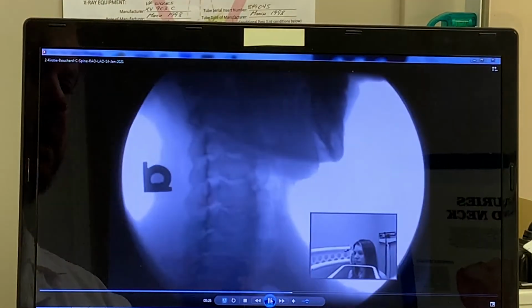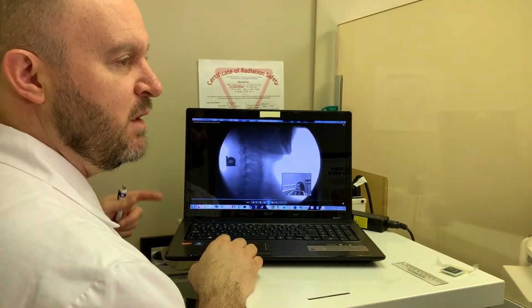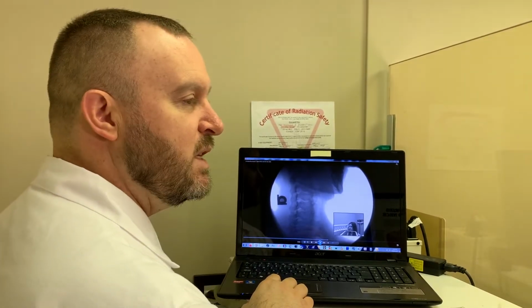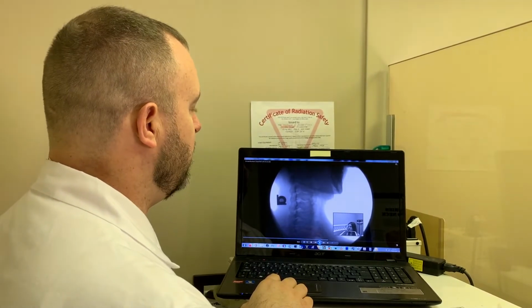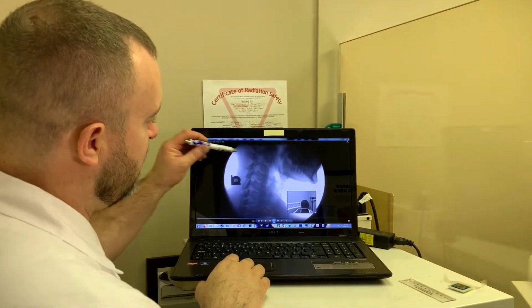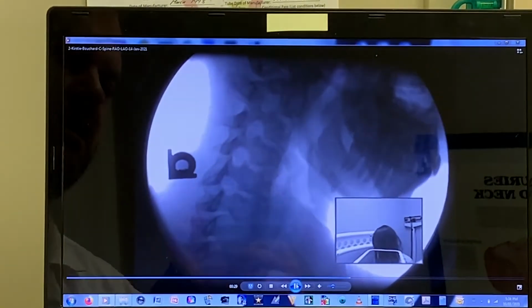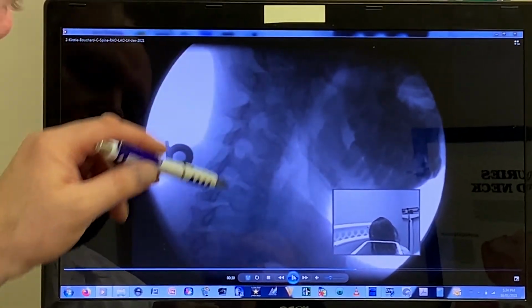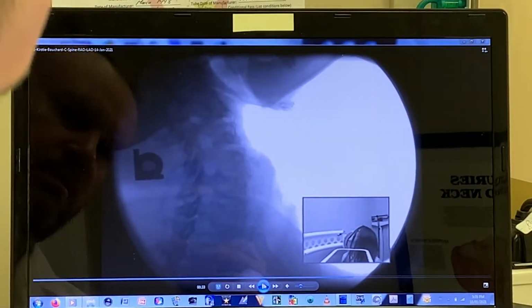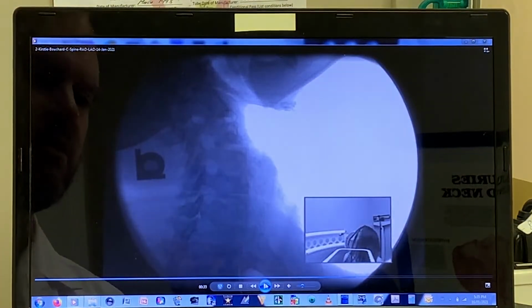That's the benefit of doing this, is that sometimes people have arm symptoms on one side, and then this compared to the other side may show that there indeed is a difference, which would likely be a possible explanation as to why they would have those arm symptoms. So again, same explanation. So these ovals are light and roughly the same size here. So as you go forward, they all get bigger. And as you go back, they're all relatively the same size comparatively to the other one.